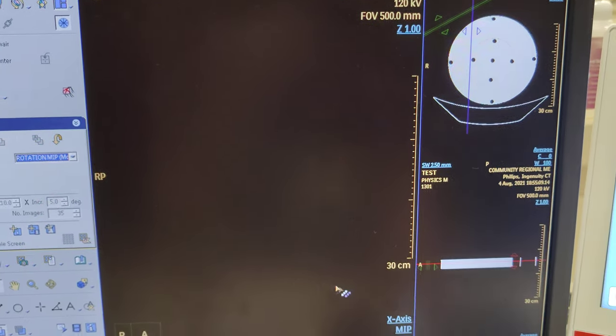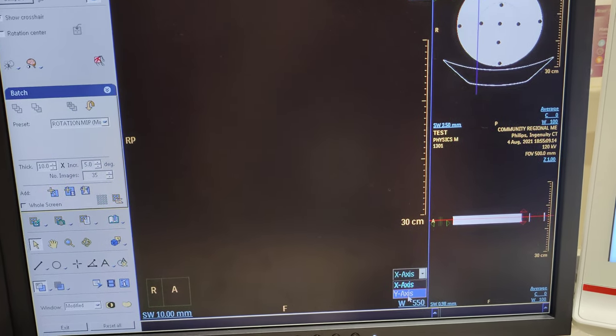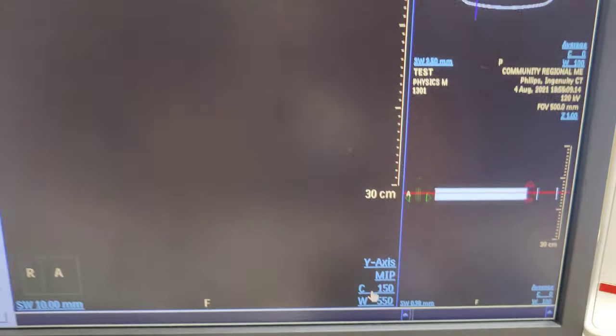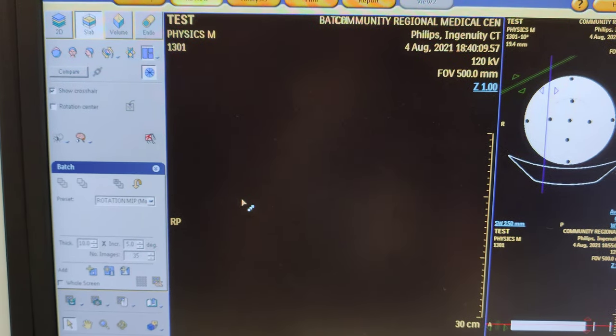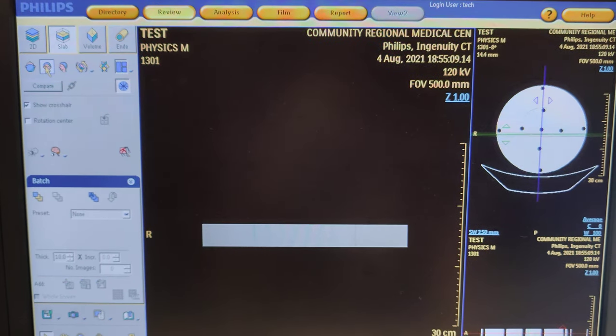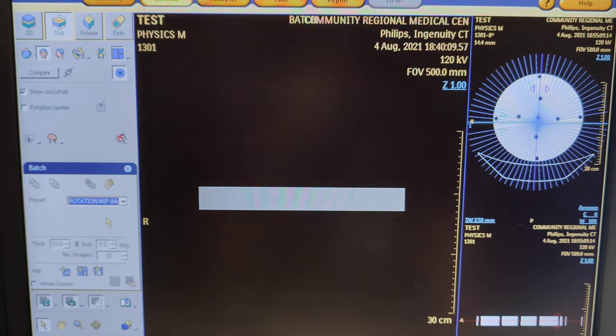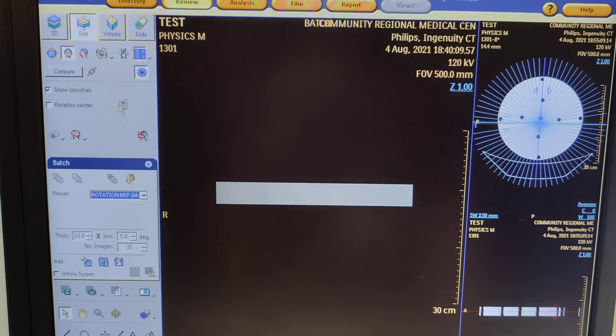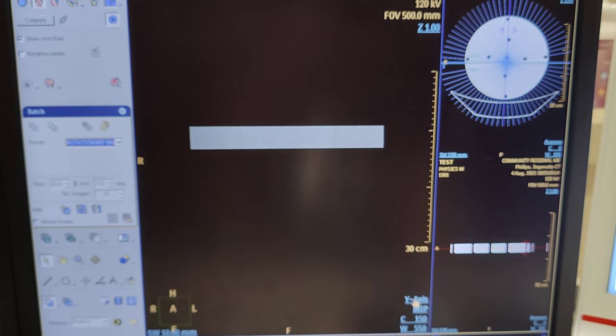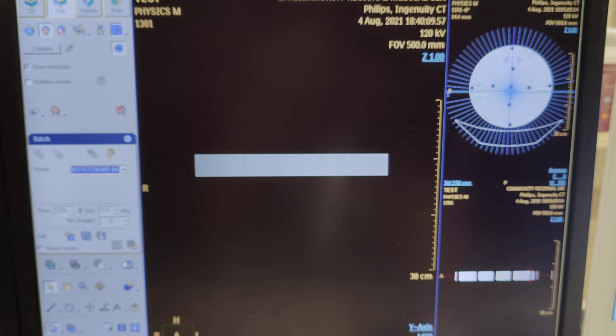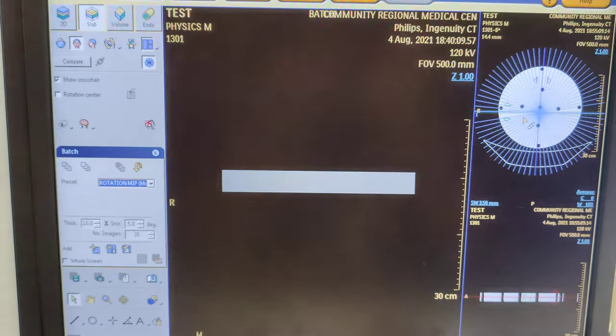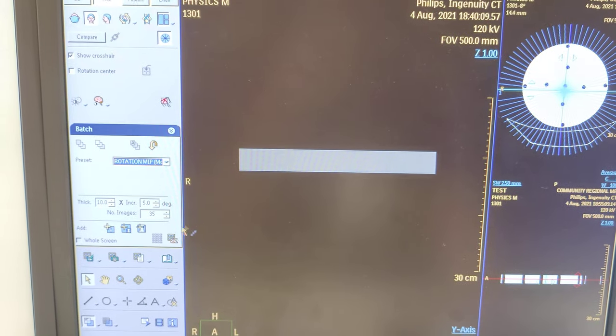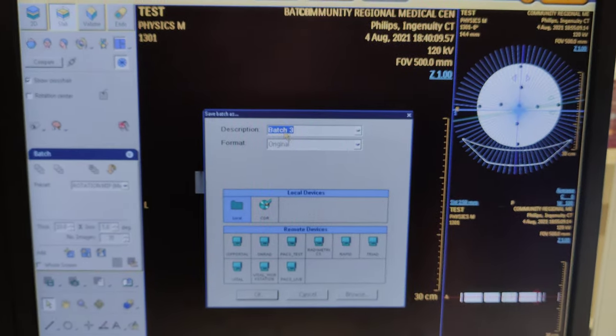You have to click this first, so you're going to come down here and it has to be your Y-axis. Rotation, there it is. So coronal, click this rotational MIP. This is going to be Y. Wait for that to come through, and that's pretty much it for the rotational. Then save it.